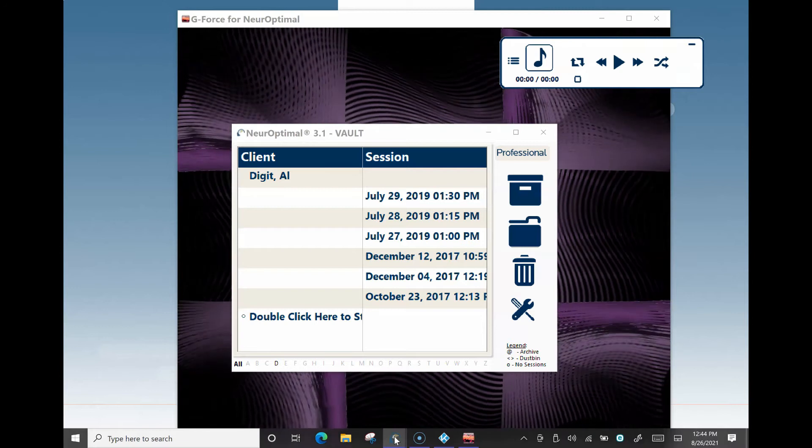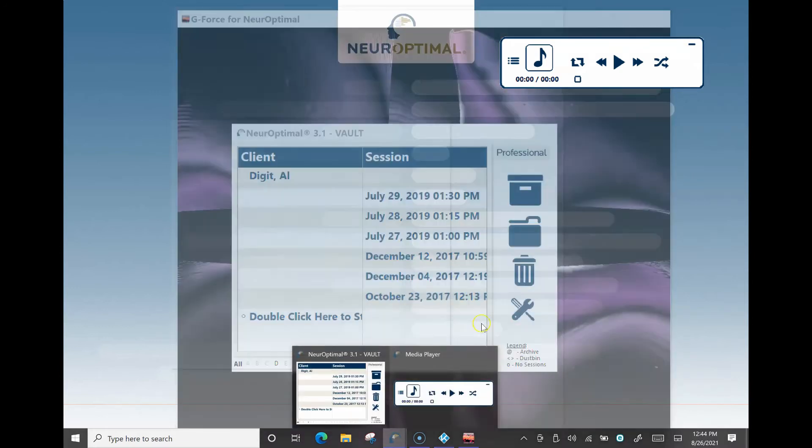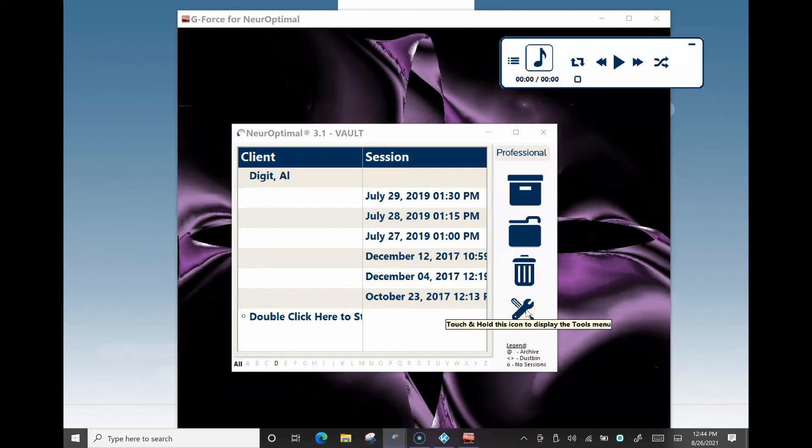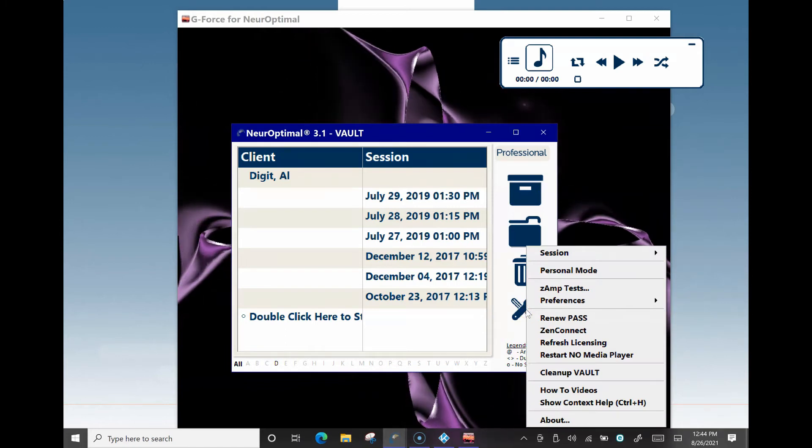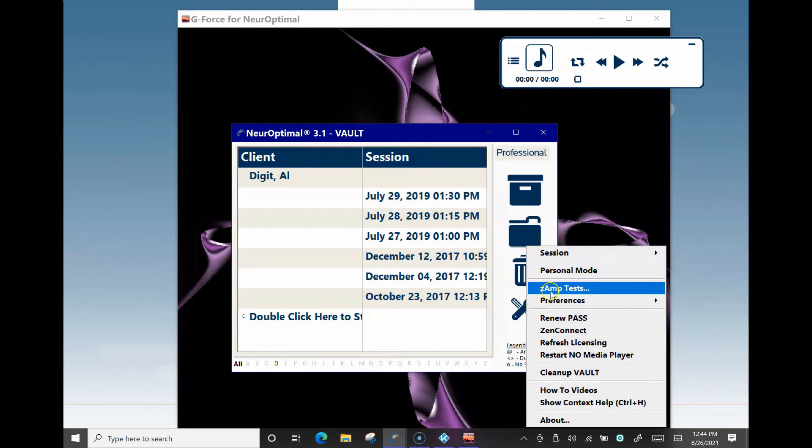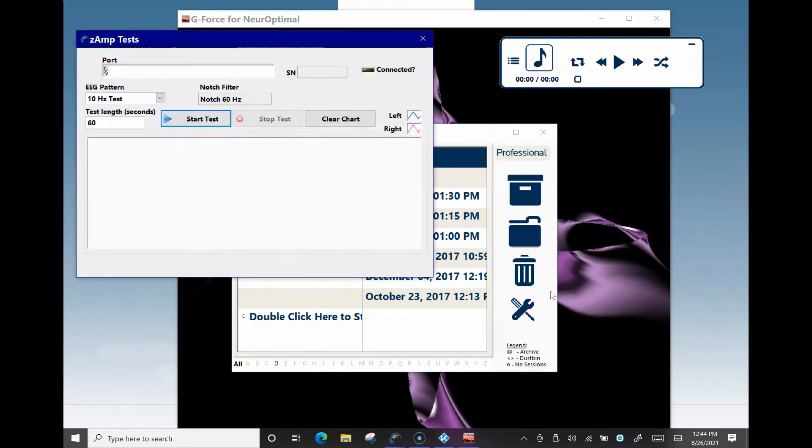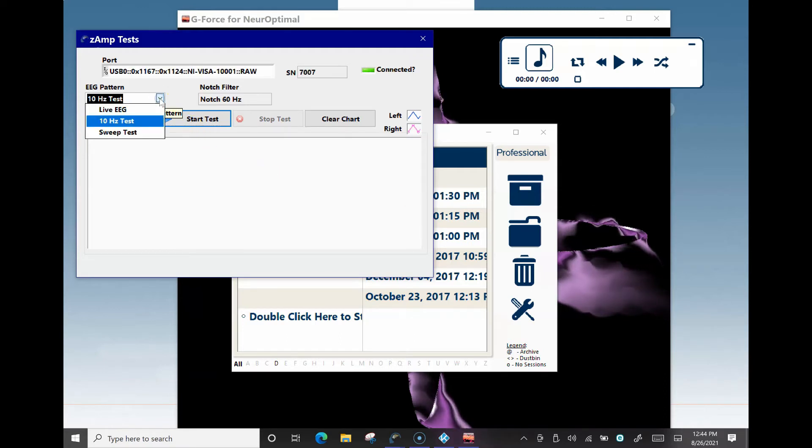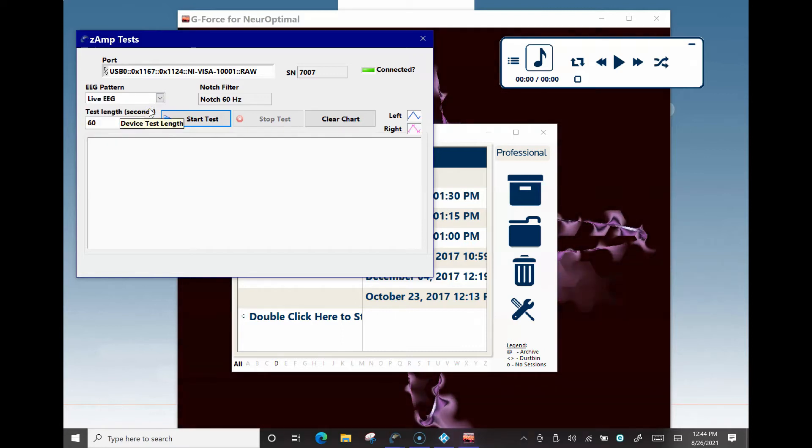Right-click on the keyboard or tap and hold on the screen for a moment on the Tools icon in the Vault window. Left-click or single-tap on the Z-Amp Tests option. Left-click or single-tap on the EEG Pattern drop-down menu. Left-click or single-tap Live EEG.